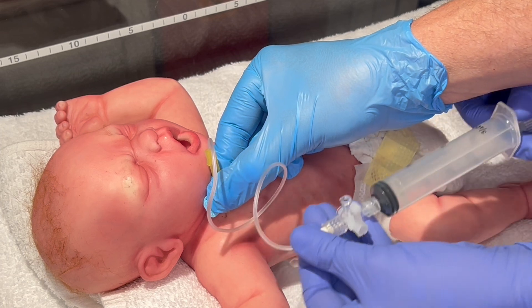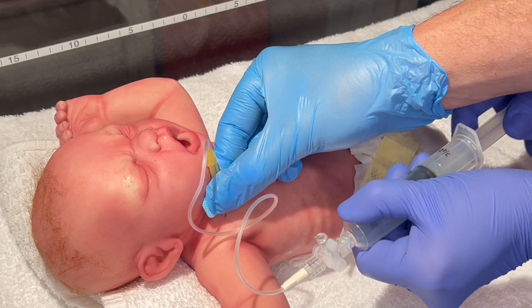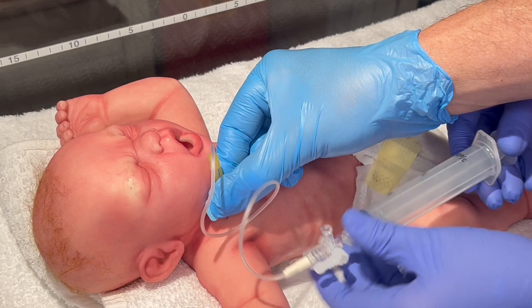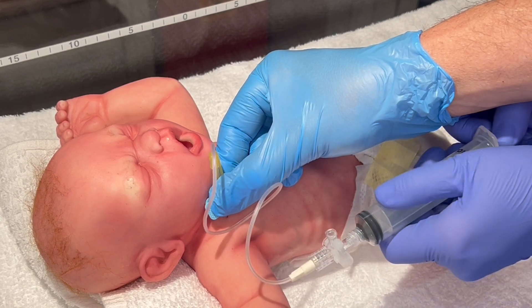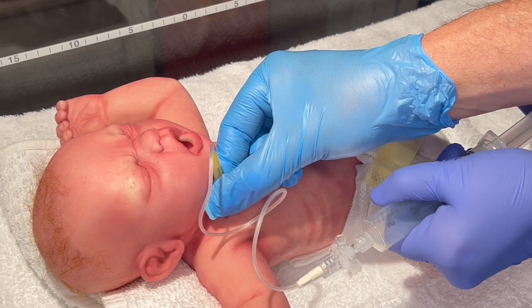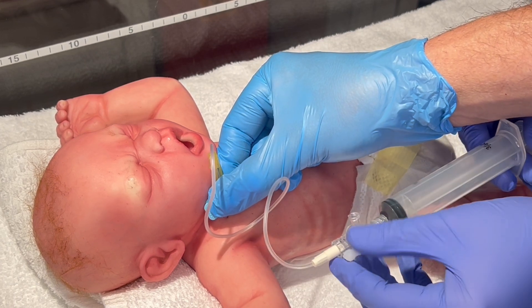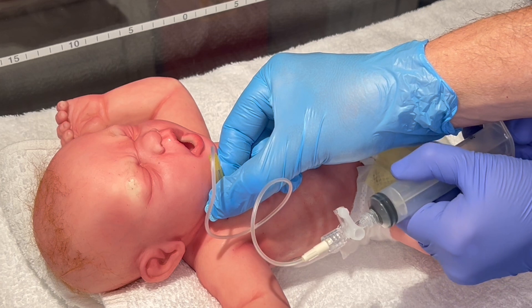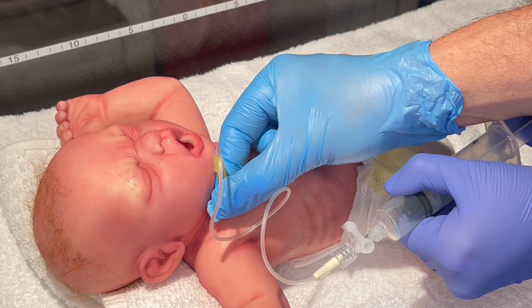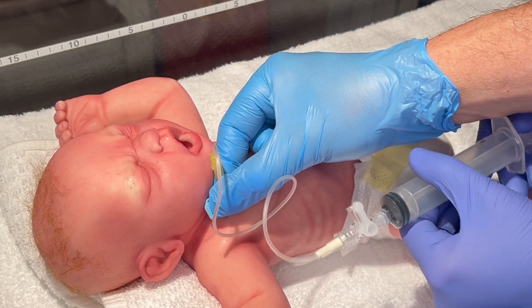Make sure that your stopcock is off to the atmosphere as you withdraw air from the chest. You then turn off to the patient and push the air out to the atmosphere. Turn back off to the atmosphere. Withdraw again if there's still air in the chest, holding the needle very steady. You then go off to the patient, back out to the atmosphere, and repeat as needed. Once you have withdrawn all the air from the patient's chest and you're sure there is no more to accumulate, you can then stop withdrawing air, place the gauze over the needle, and remove.